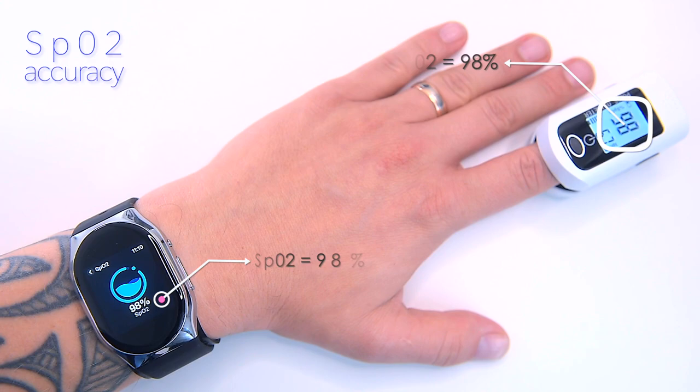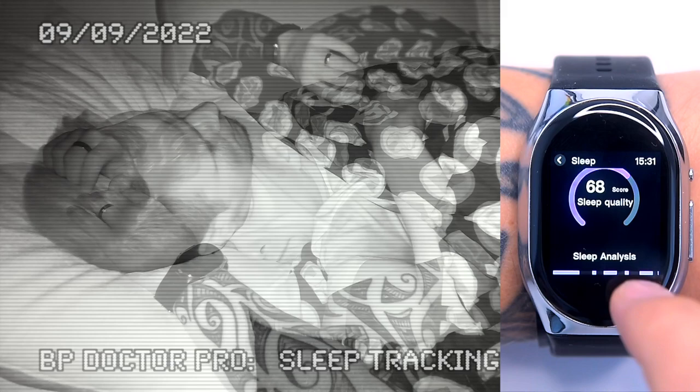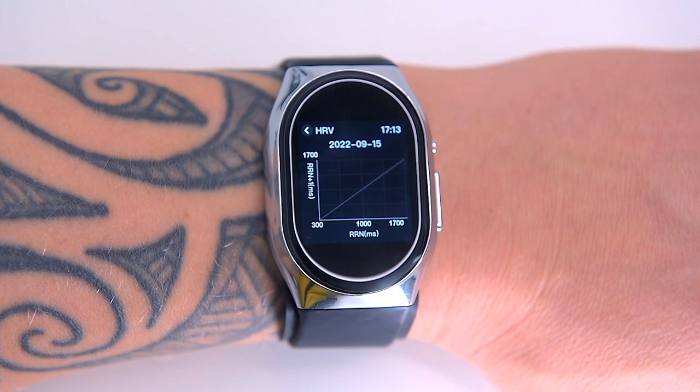Sleep tracking in BP Doctor Pro is very consistent, though I wasn't able to scientifically confirm this. Wearing the watch to bed a few times, I was able to detect the time I fell asleep, deep sleep, light sleep, and awake time. The watch can also be set to alert you about apnea, which is a serious sleep disorder. The BP Doctor Pro can also track HRV, which is the fluctuation in the time intervals between heartbeats.